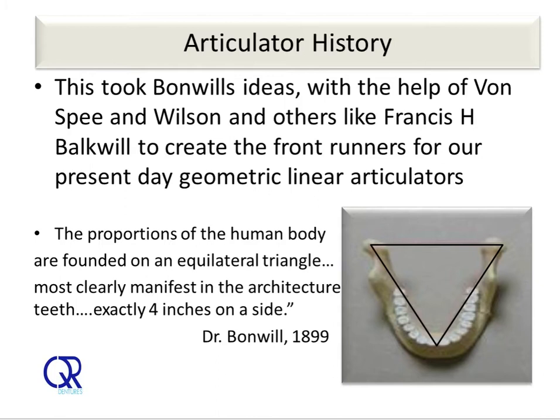In 1864, Bonwill introduced his equilateral triangle theory, establishing the size of the mandible as 4 inches from condyle to condyle and from each condyle to the incisor point. Bonwill believed that the articulation of the teeth guides the mandible during function, but that the centres of the condyles are also the centres of lateral rotation for the mandible's opening and closing movements.